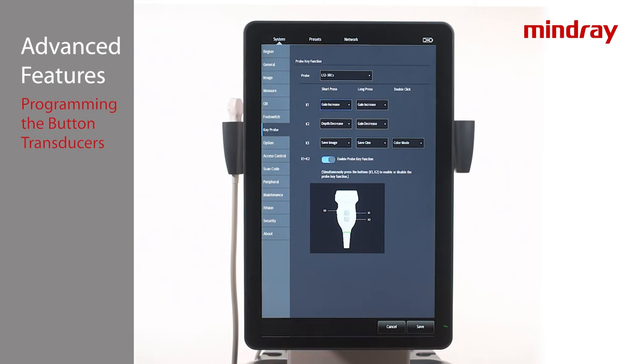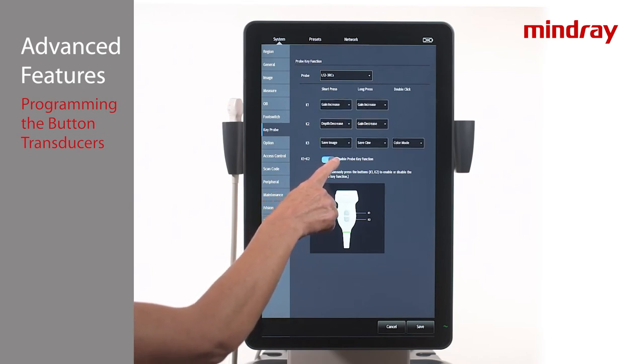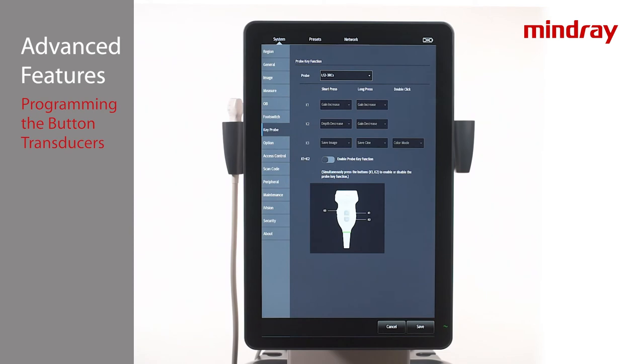Buttons may also be disabled by sliding over the toggle labeled Enable Probe Key Functions to the left. Also, simultaneously pressing K1 and K2 will disable or enable the buttons during use, so that there is no need to return to the setup pages while scanning.